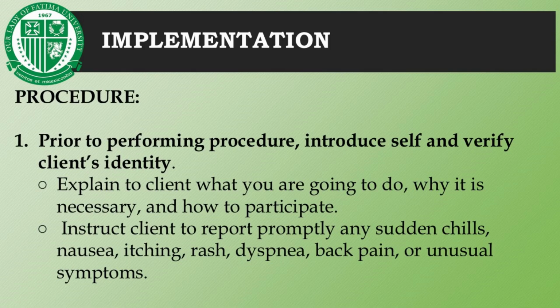Prior to performing the procedure, introduce yourself and verify the client's identity. This step includes explaining to the client what you are going to do, why it is necessary, and how to participate and understand. Instruct them to report promptly any sudden chills, nausea, itching, rash, dyspnea, back pain, or unusual symptoms.